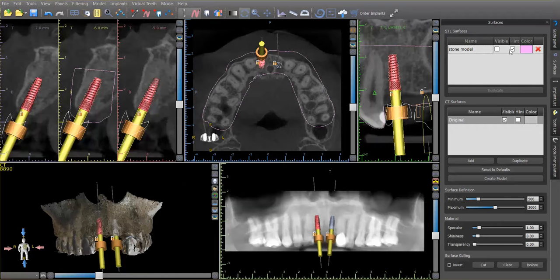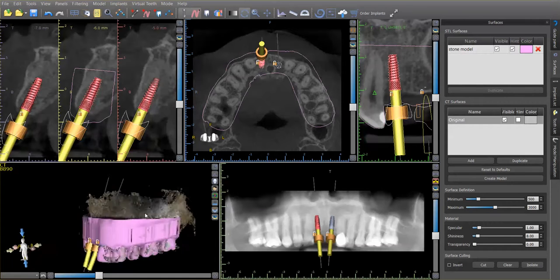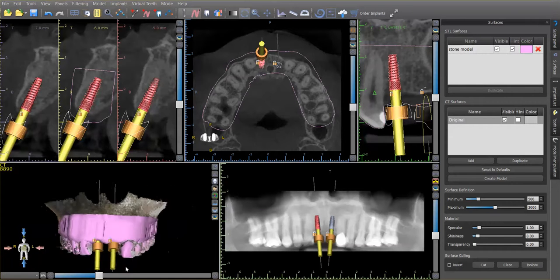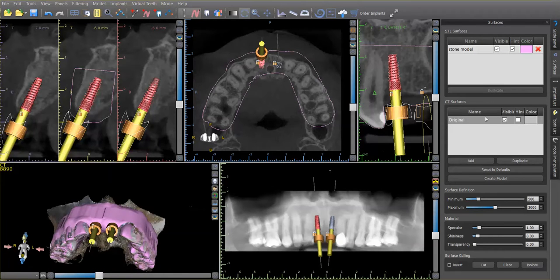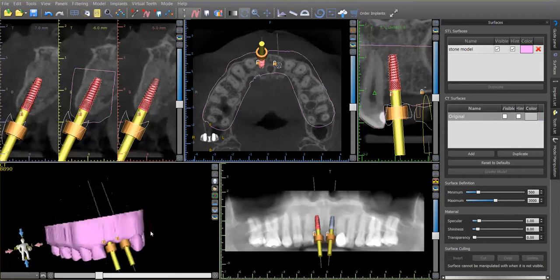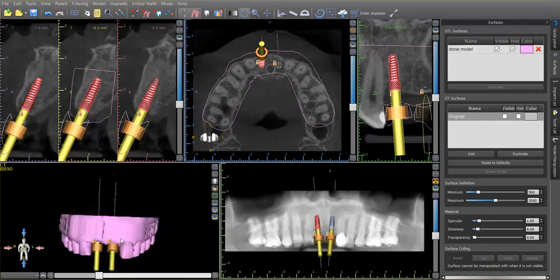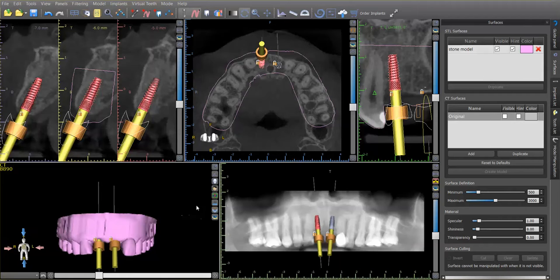So what I'll do is turn on the STL model. We've already done our treatment planning on the cone beam data, and so now we can turn off the cone beam rendering. As you can see, I've got the implants turned on and I'm going to turn off all of the models in this right-hand side — the CT surface, any other STL models that you may have.